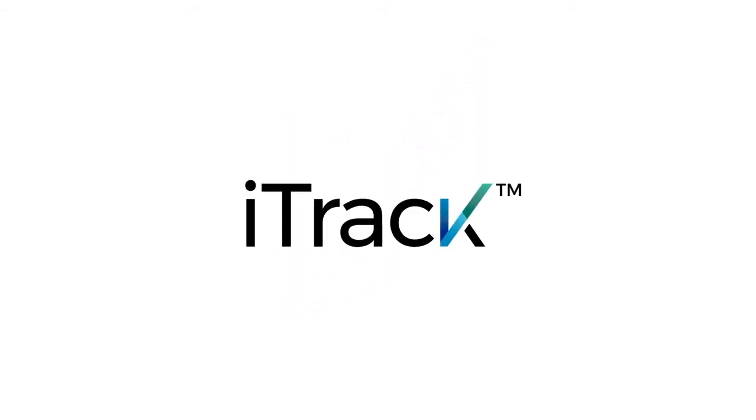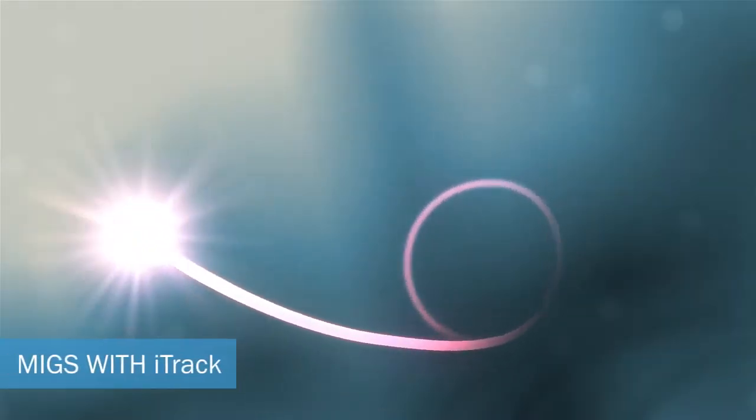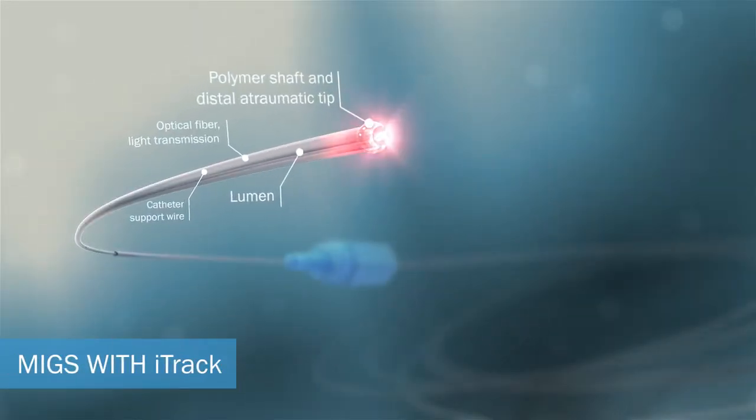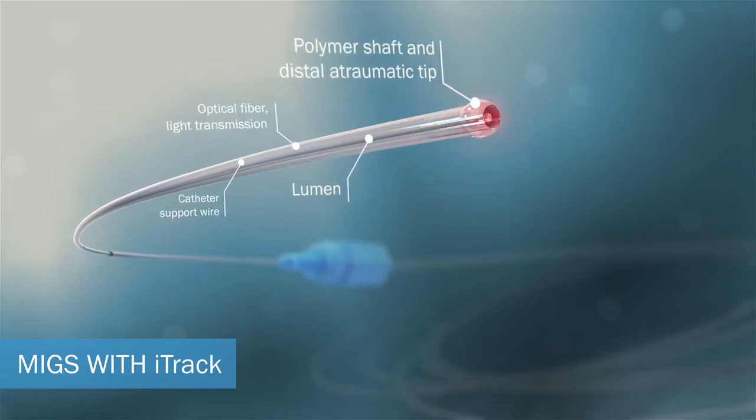Introducing EyeTrack, the only illuminated microcatheter designed for minimally invasive glaucoma surgery with ab interno canaloplasty.